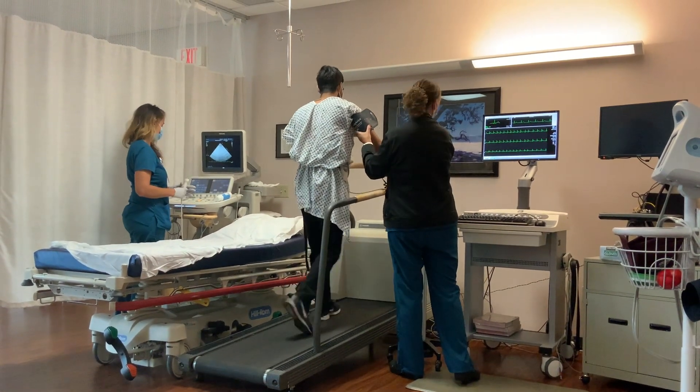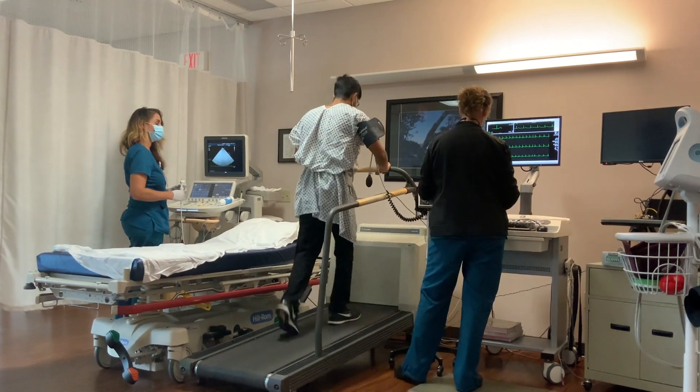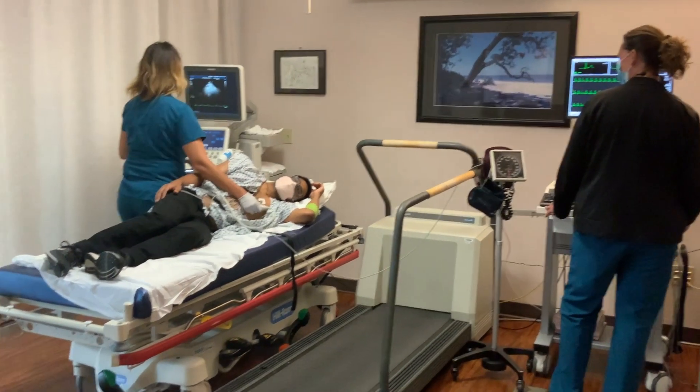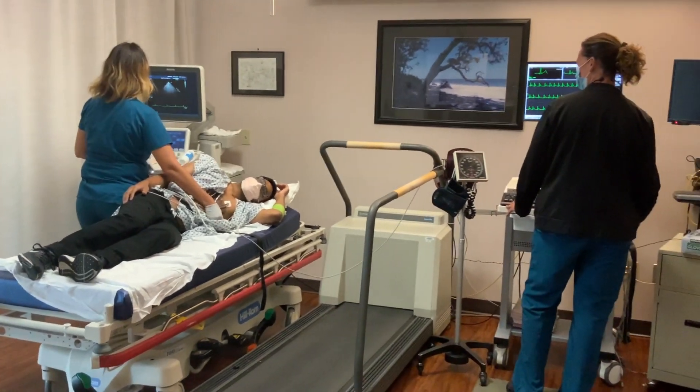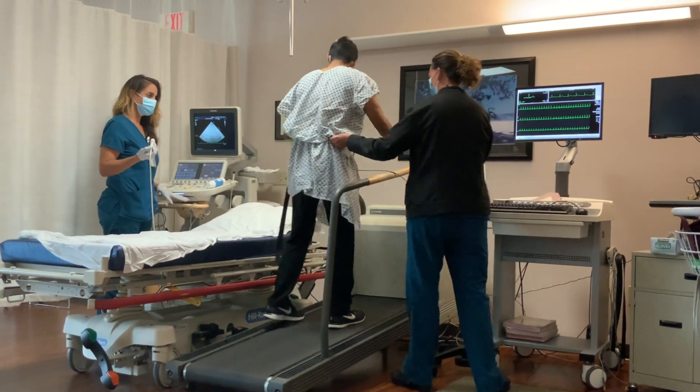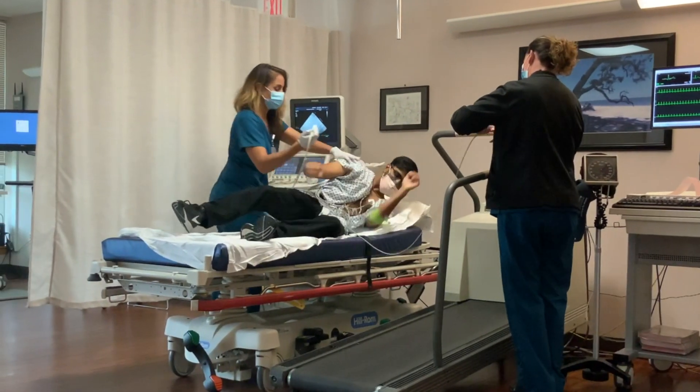You will have an EKG machine record the electrical signals coming from your heart during rest and with activity. You will get an ultrasound of your heart twice, once while laying down at rest and once after your heart rate is high enough. This test can last approximately two to three hours.